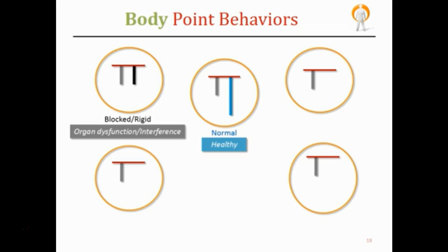The next behavior is hyporegulation. This is when the second reading hardly changes and is nearly blocked, changing less than the normal amount, meaning less than 3/10 of a degree. Although hyporegulation is not as severe as blocked regulation, it should be noted.